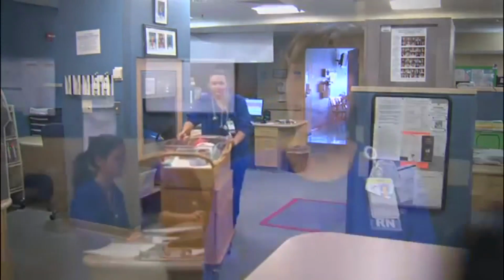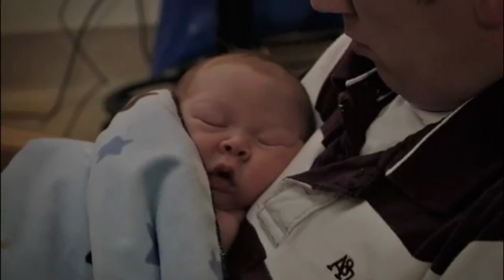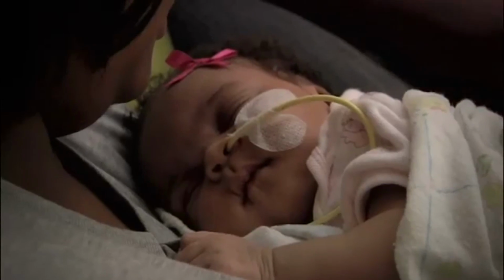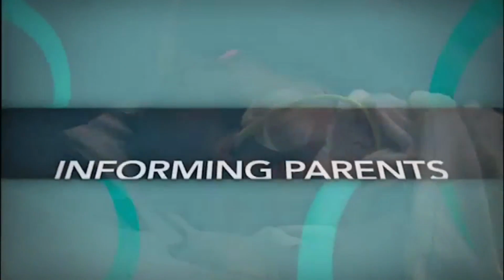We've been doing the CCHD testing here at Holy Cross Hospital since January of 2009. Our goal is to show other hospitals that this can be done whether it's a university setting or a community hospital setting. All infants should be screened. It is recommended that screening occur after the baby is 24 hours old to allow the transition from fetal to newborn circulation and decrease the number of false positives.